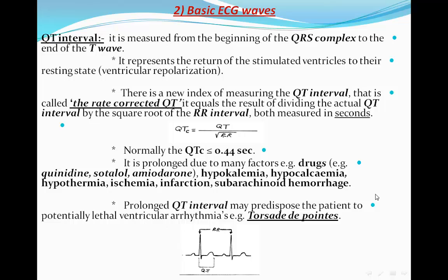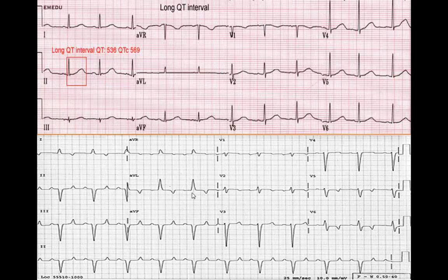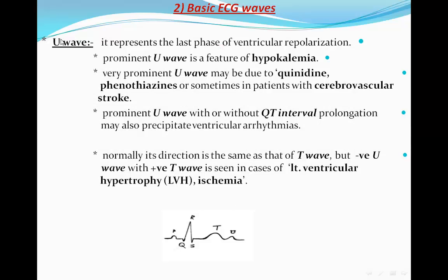Here is an example of prolonged QT interval, measured from the beginning of the QRS complex to the end of the T wave. The actual QT interval here is more than 0.44 seconds — there are two big squares, which is 10 small squares, plus one more. After rate correction, the QTc became even more prolonged at 0.569 seconds. In another example, the interval spans one big square, a second big square, and about two more small squares — approximately 12 small squares total.